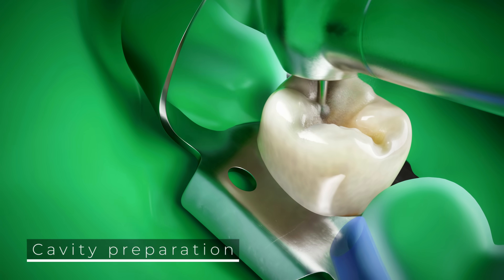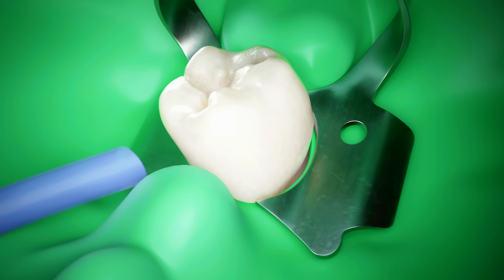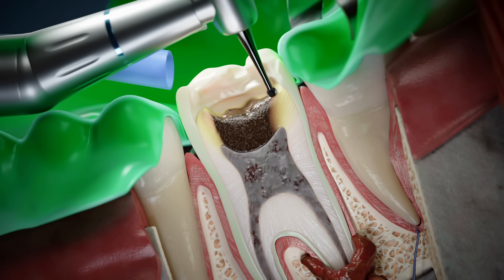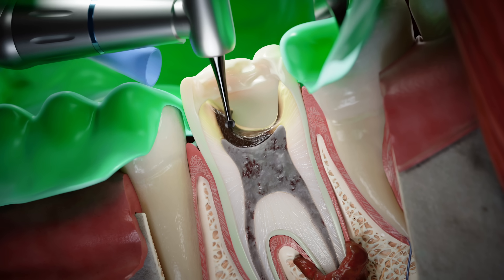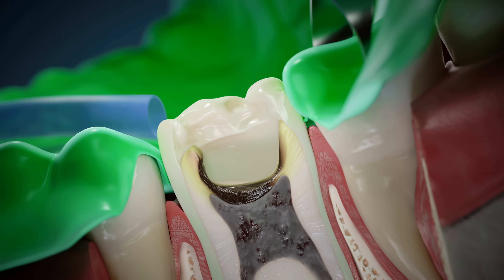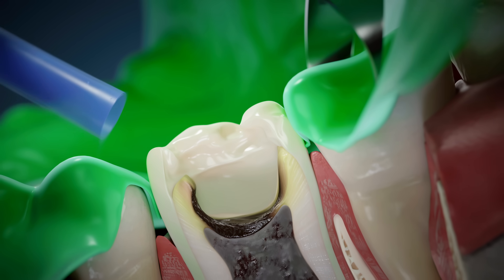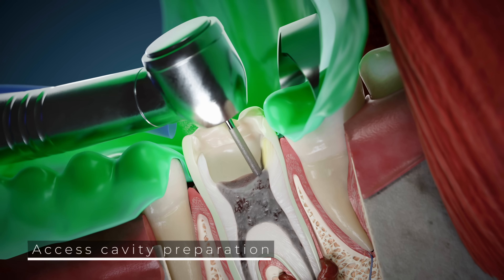Damaged enamel is removed using diamond burrs with water cooling. Infected dentin is thoroughly excised using carbide burrs. Continuous disinfection is necessary to prevent further bacterial penetration into the root canal system and periapical tissues. Direct access to the pulp chamber is ensured.